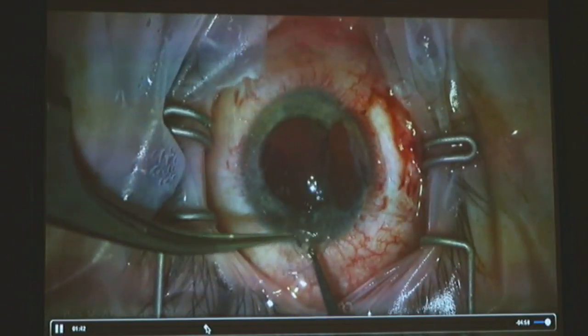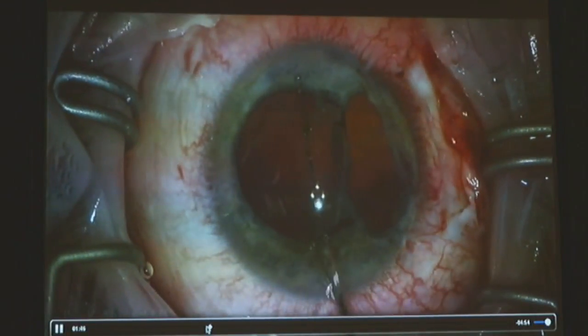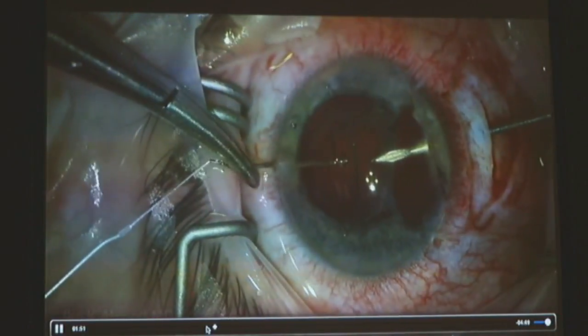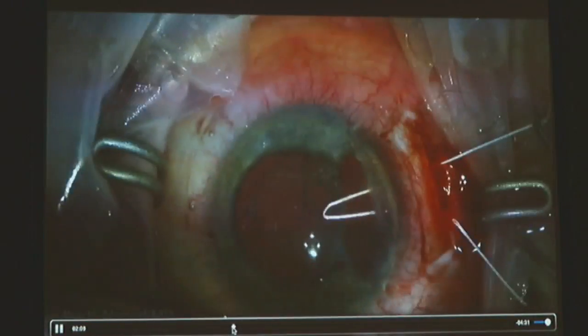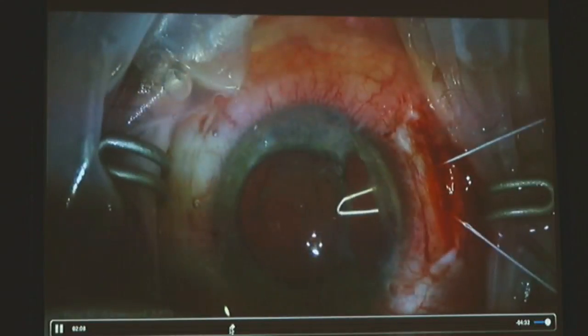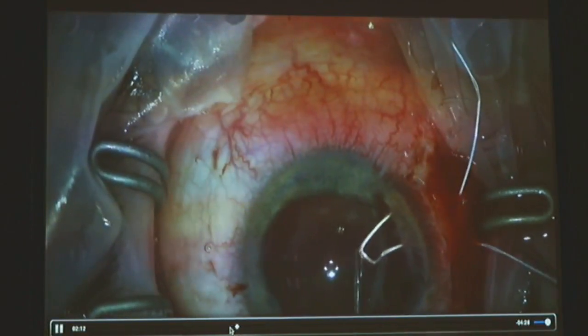And I thought, okay, this is a good option for CTS, right? No, it's not. How do you know that, Lupe? How do you know it's not? You know it. Okay, well, I passed my sutures. Okay, this is looking good. I'm going to be fine. I put it in the bag, and watch, when I pull it, look what happens. The CTS torques. It's coming out of the bag because there's too much tension there.